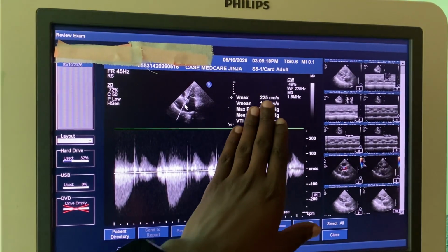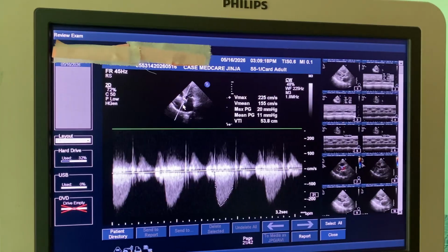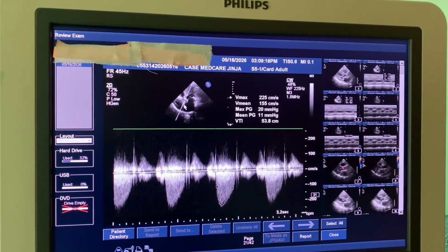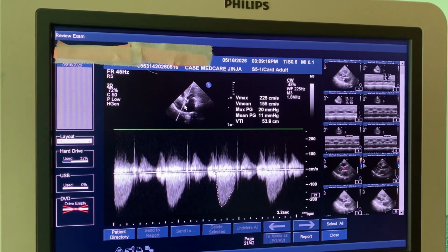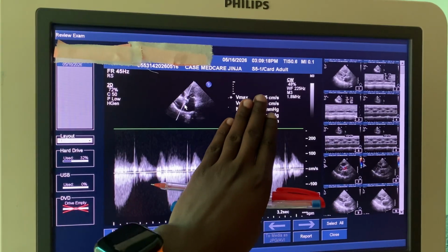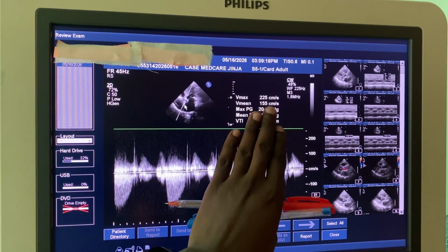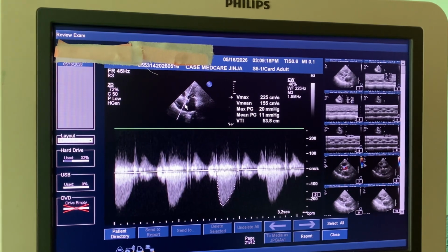So that means this low flow is in the velocity. Yes, low flow. We are talking about velocity now, or ejection or stroke volume passing. So this one is abnormally low. We cannot take it because of that one thing. But also in elderly patients, they normally come with that thing: low flow, paradoxical low flow.